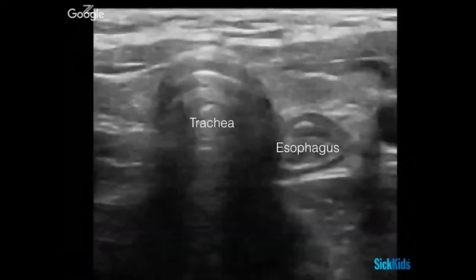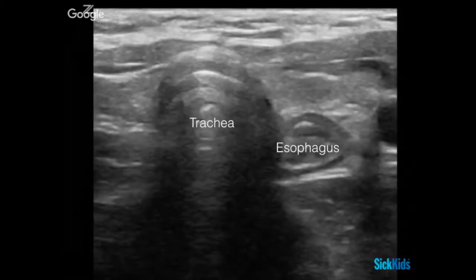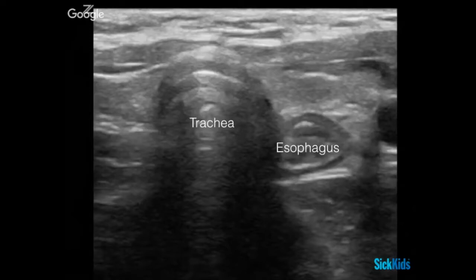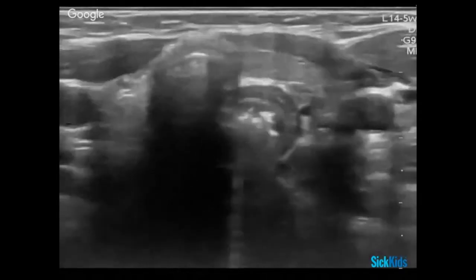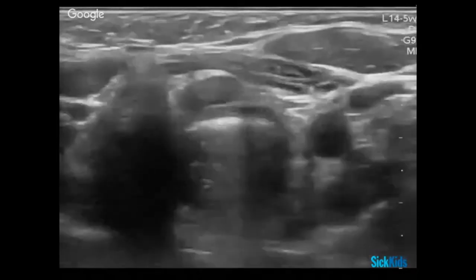Our final section is going to be on esophageal foreign body. Those familiar with the airway lectures will recognize this image — a trachea and esophagus in transverse view at the base of the neck. We see the trachea as the larger air-filled structure giving shadowing deep to it, with a small muscular area to the side containing the esophagus. When we think about foreign body ultrasound of the neck, we're really utilizing our same airway ultrasound but focused on the esophagus.